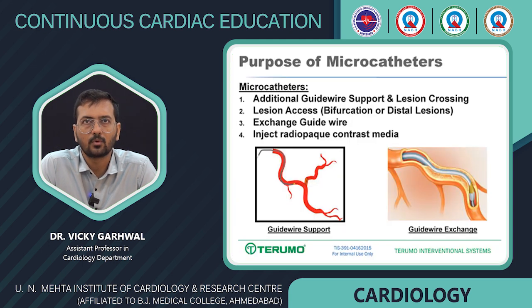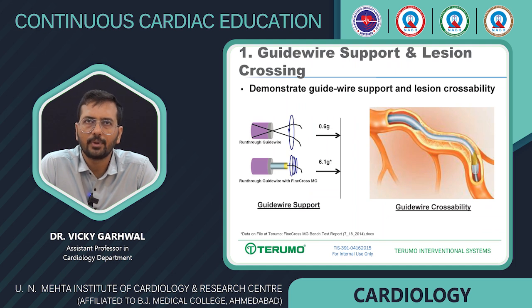Coming to the coronary microcatheters. The purposes or uses of the microcatheter are additional guide wire support and lesion crossing, lesions in case of bifurcation and distal lesions in CTOs, exchanging the guide wires, and injecting radiopaque contrast material. So, guide wire support and lesion crossing.